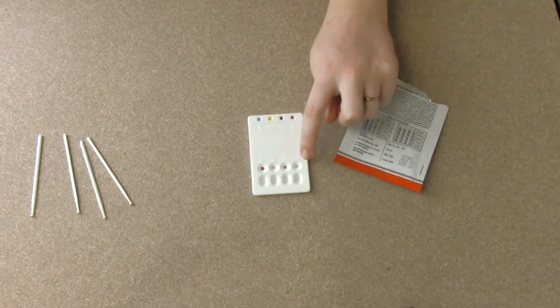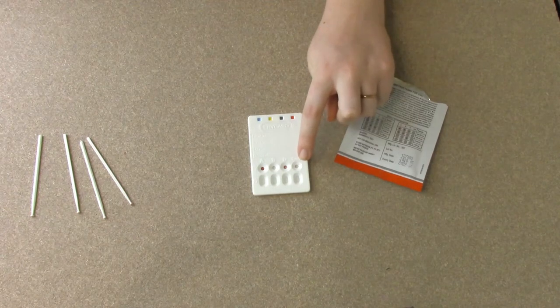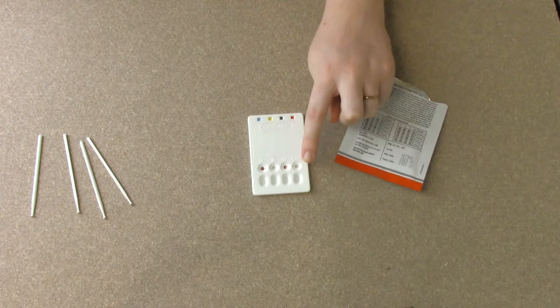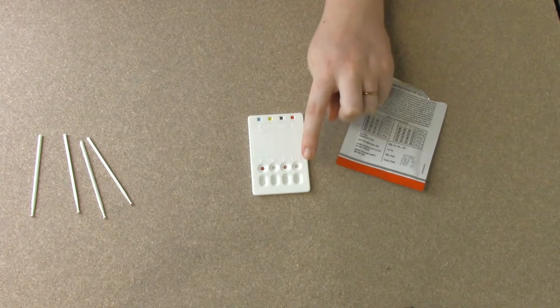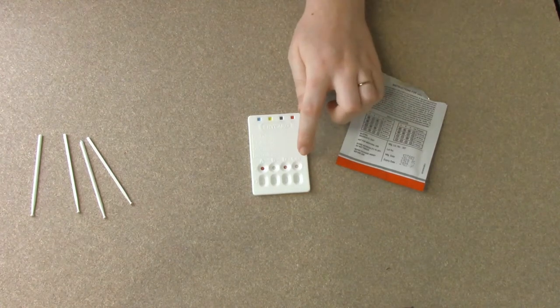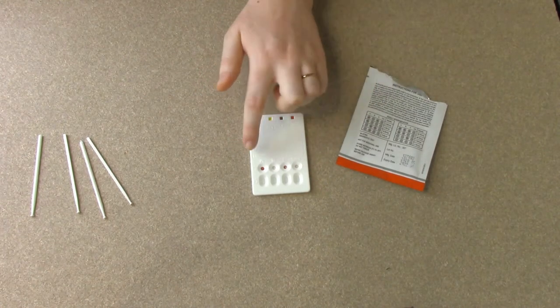It looks like the control has turned clear as well. Now it is really important that the control turns clear. This is how we tell that the test is valid. Because it is turning clear, I can trust that the rest of my result is accurate.